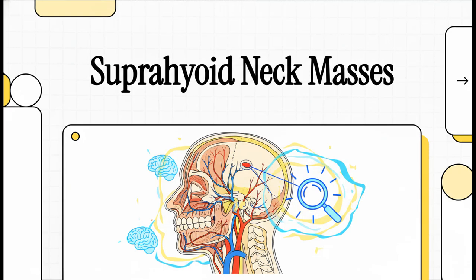All right, let's talk about one of the biggest headaches in head and neck imaging, the suprahyoid neck mass. It can seem totally overwhelming, but believe it or not, there's a beautifully simple, systematic approach that can cut right through all that complexity. So let's dive in.